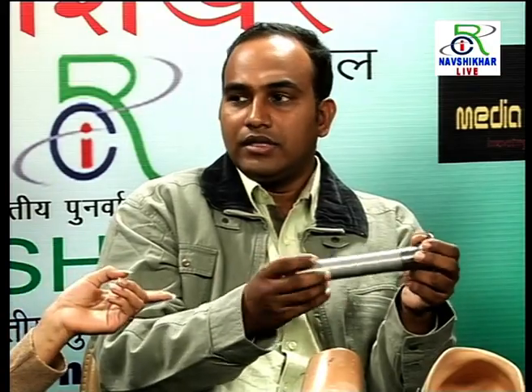So this one is titanium. Yeah, this one is titanium. No, this is, I think, aluminium alloy. The knee joint adapter is made of titanium. Adapter is made by which company? This is from Ottobock.